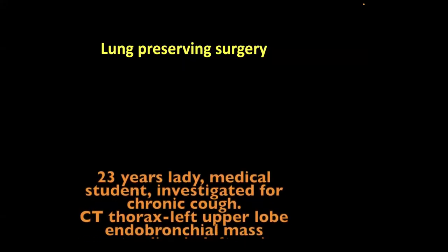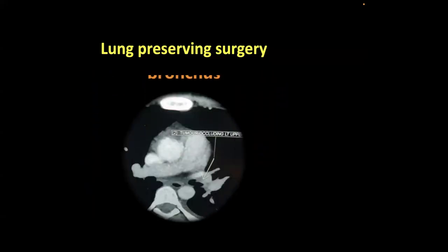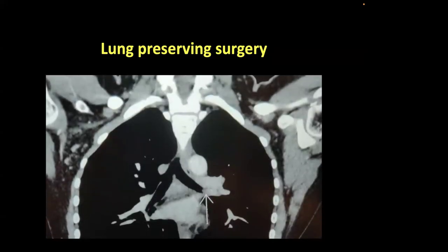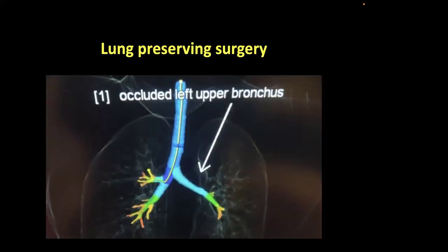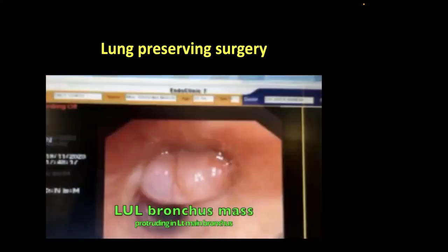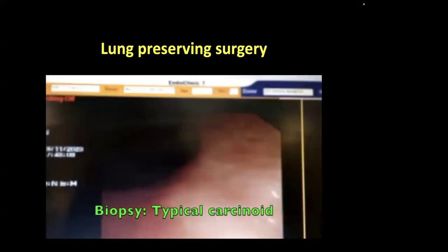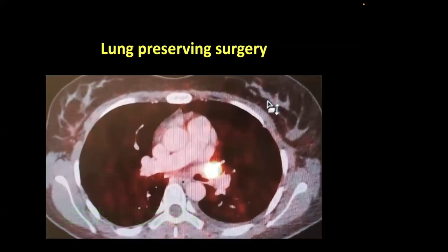I am a great fan of lung-preserving surgery, and for central tumors I would like to do a sleeve lobectomy. There was a medical student who came to us from Russia, who had a carcinoid arising from the left upper lobe bronchus and going up to the left main bronchus. In order to get clear margins, as you can see in this bronchoscopy, we might have had to do a pneumonectomy.